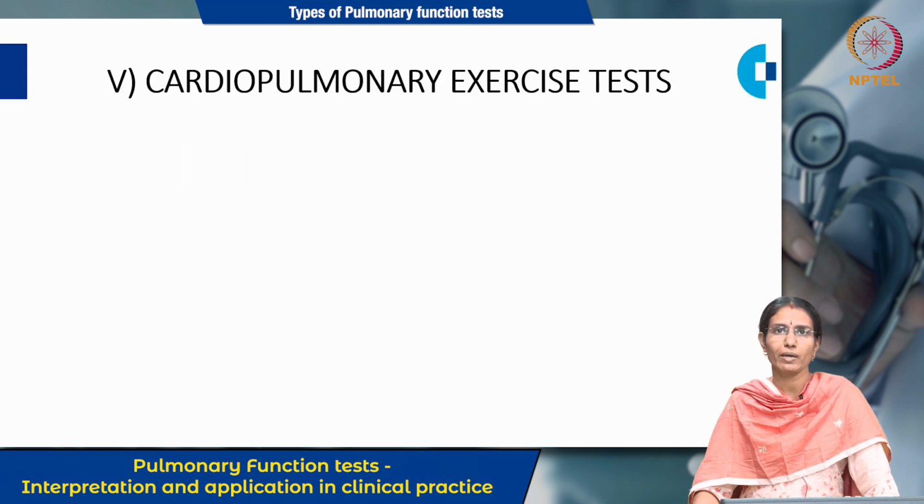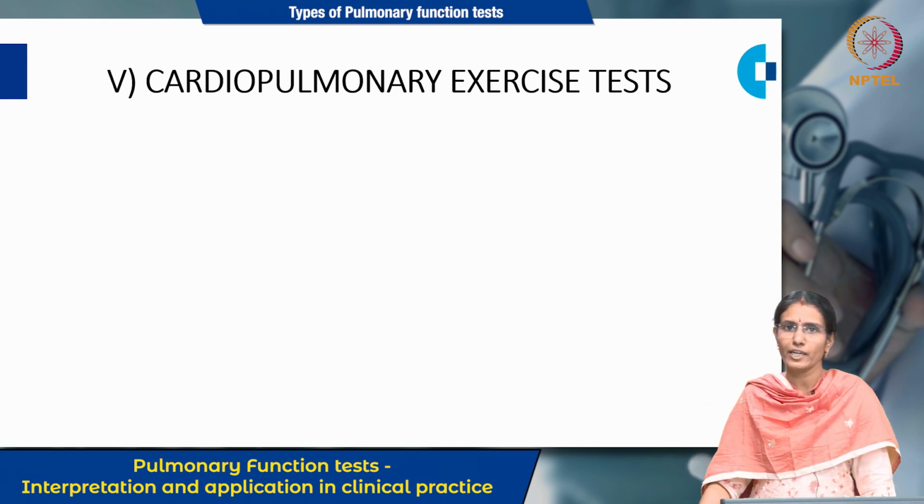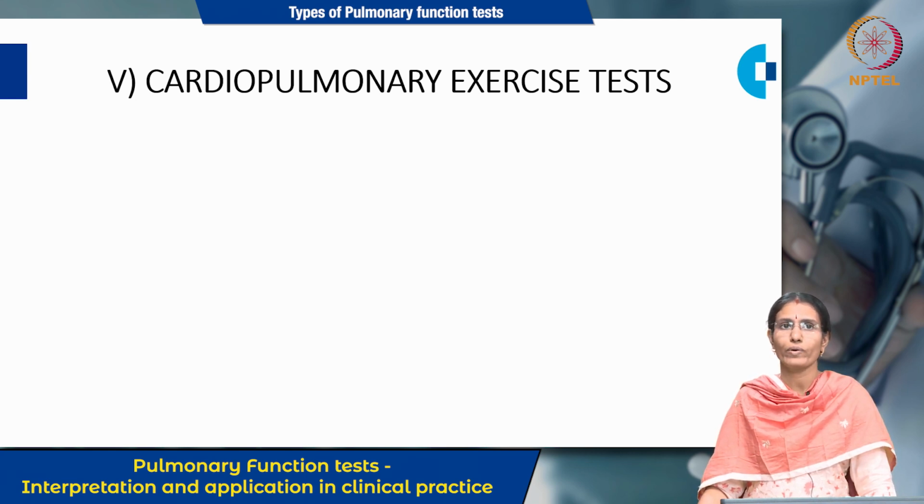What are the other pulmonary function tests? Cardiopulmonary exercise tests. We have seen the 4 different pulmonary function tests which are very widely used clinically for diagnostic purposes. That is, tests of airway functions, tests to assess the lung volumes and ventilation, and diffusion capacity, which is also widely used.